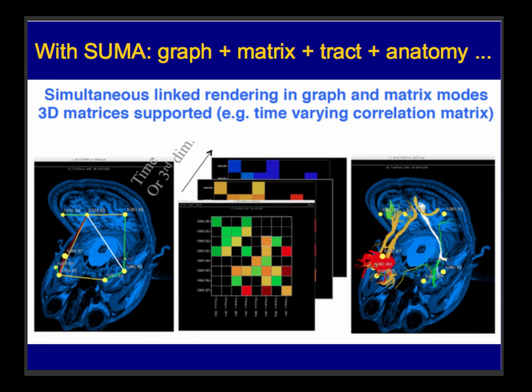And so if this represented functional connectivity, that would be the correlation of those time series. And I could look at that in space to get a sense of, well, for example, I might be interested whether closer parts of the brain have higher correlation or something like that. There's lots of other types of information we can look at, and we'll talk specifically about structural information. And by structural, we mean white matter tracks. And so this is a way of looking at properties on the tracks themselves that may be connecting different regions.